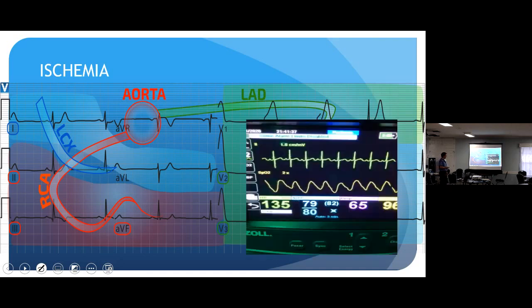So again, I think that EMS providers, medics should better pick up STEMIs. Okay, and the reason I say this is the machine is not correct. If you talk to the manufacturer of LifePak or Zoll, these folks, they'll say about 93% accurate. I would argue probably not. I don't trust the machines. You got to have that human factor.